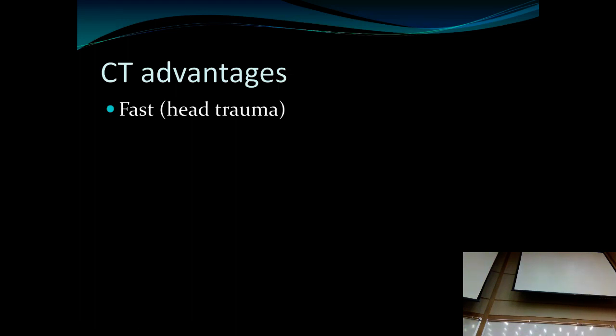So there are specific indications, and this is really important. You work in the emergency room, or seeing a patient there, and it's your choice. Do we want a CT or do we want an MRI scan? CT images are very fast. Okay, we can just get the patient down to the radiology department, get the images, get the information right away. So that's an advantage.